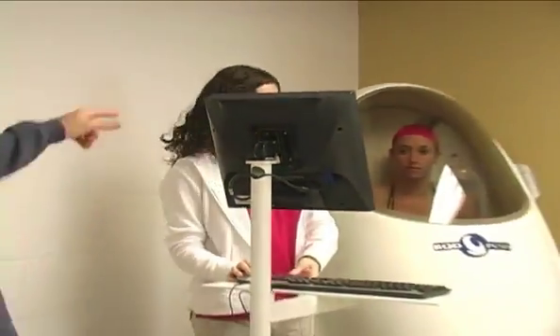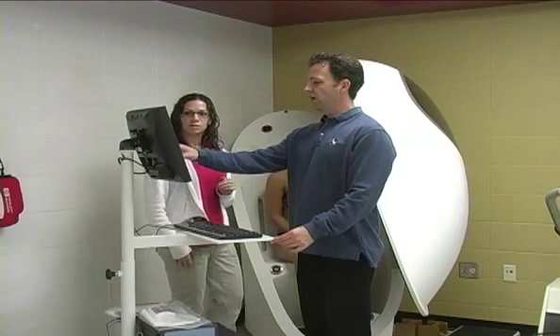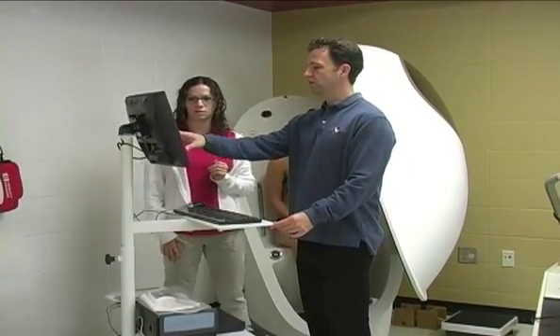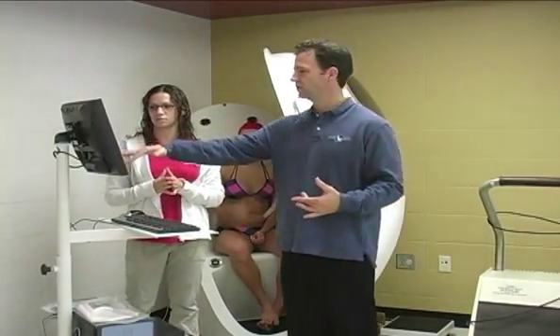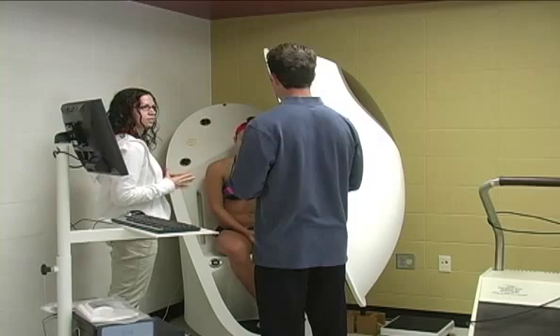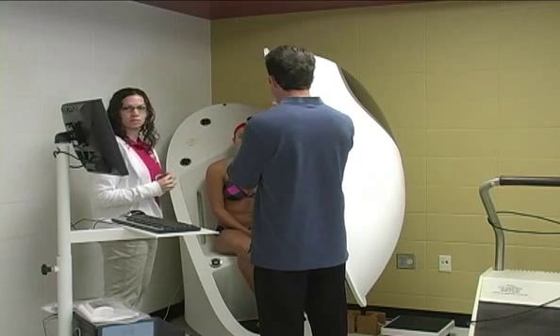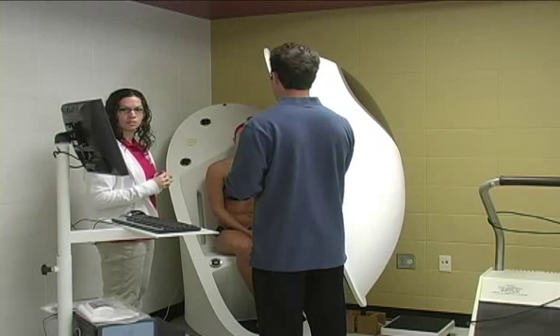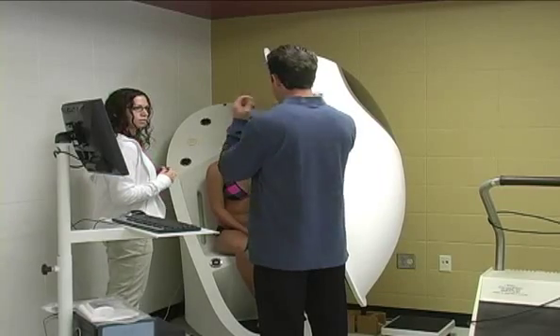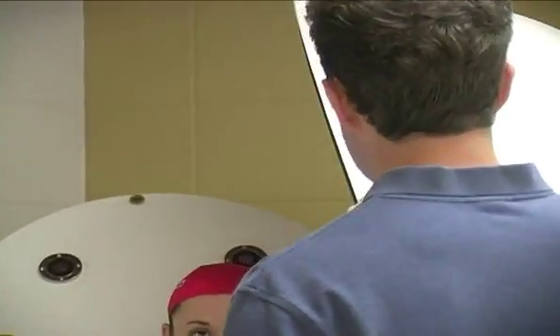Let us know if you can see it as it comes up with the screen. Do this again. So her merit and airway were too high. Same thing that happened with Brittany, so you just need to repeat it, and it tells you high. What I would recommend is, merit is typically compliance. Why this may be high is if you broke the seal either during just putting the tube in your mouth or the huff. A lot of times, I couldn't hear you, but when you were huffing through the tube, if any air leaked out, that will usually be a clue. Okay? So just try it again, maintain a tight seal, huff ever so lightly, it should be good.